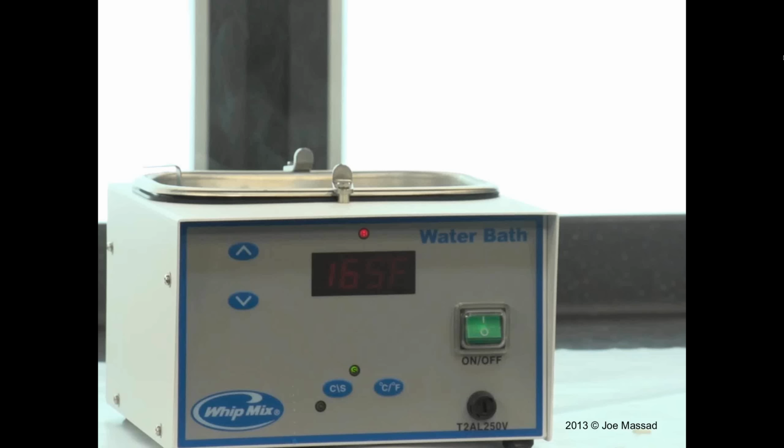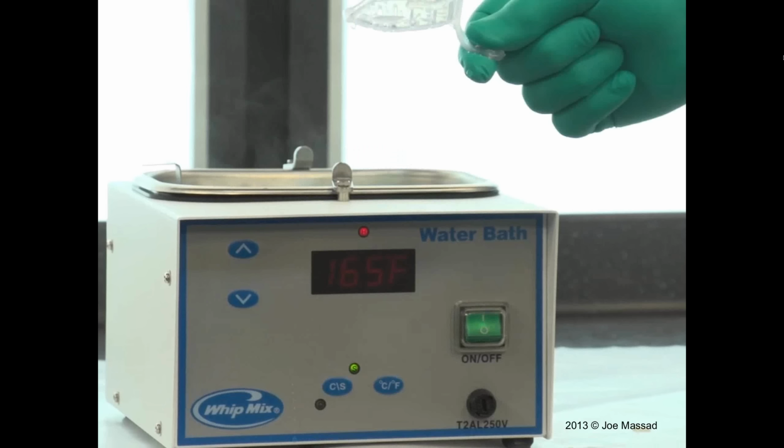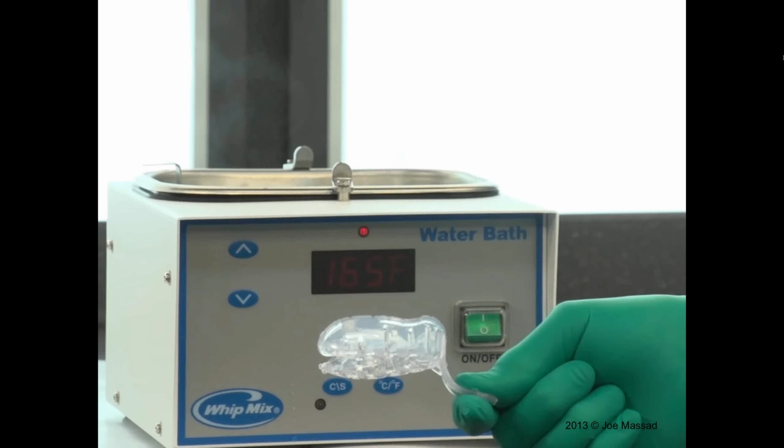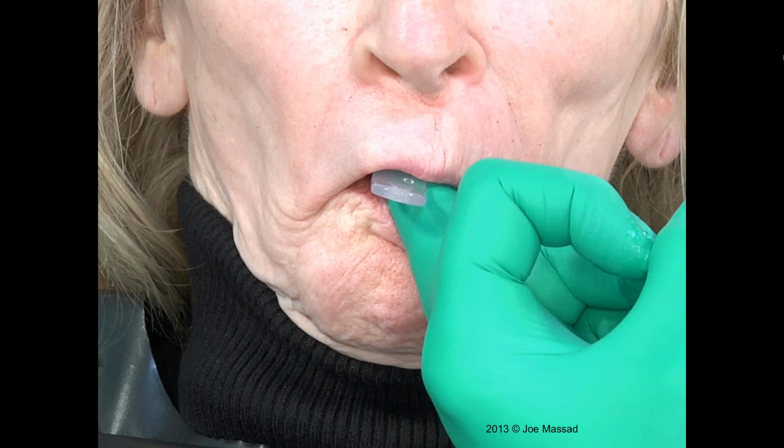Now we're going to use a controlled heated water bath, and we're going to put in a clear tray which is thermoplastic and can be shaped directly into the patient's mouth. The rationale behind this is, instead of making a second appointment for the custom tray, it's extremely efficient and accurate if we can use a thermoplastic tray that's moldable in the patient's mouth. We don't want to oversize it, but we'll let the patient compress it. So the patient is going to suck inward. They're going to smile a little bit, and as you will see, they actually have shaped the tray. So now the tray is really shaped.